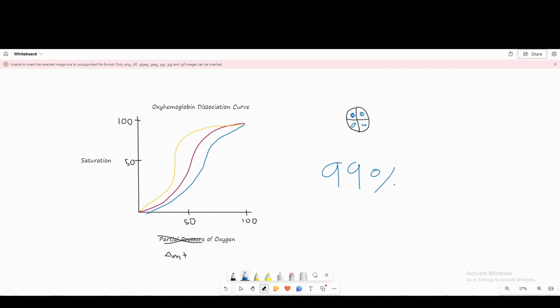So this is the more interesting side of the graph to me, and this explains our case study a little bit as well, right? So if you think about it, after we know this, we start to think about, okay, well, if we know that this side is caused by a higher pH and this side is caused by a lower pH, then what causes pH to rise and fall, right? And there's a lot of different reasons, and a lot of those are explained in my video about CO2, right? But this tells us what we want to know about the patient and their oxygen saturation.